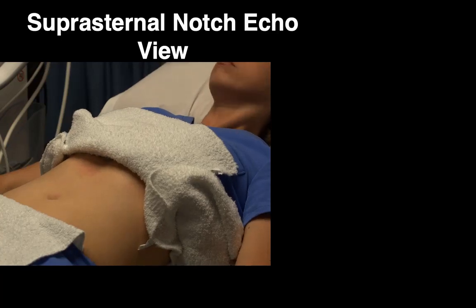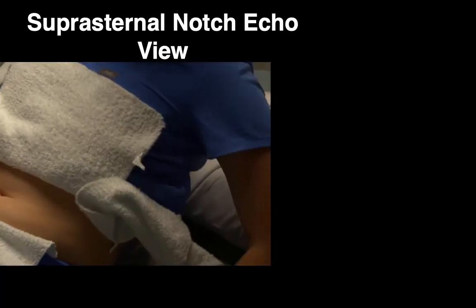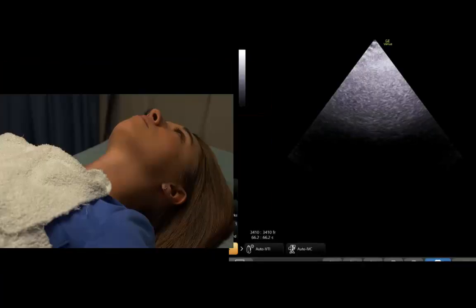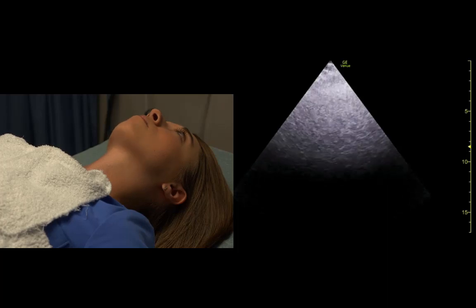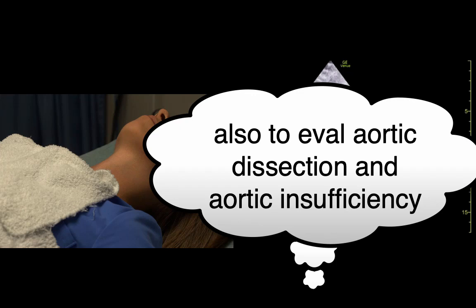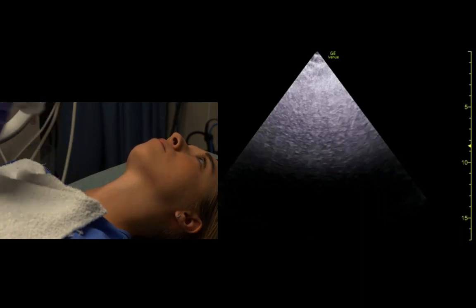I'm going to take your pillow and put it underneath your back, so your head goes backwards. This is the suprasternal notch view. If you want to look at the aortic arch, this is done a lot more in pediatrics than adults because you can get a lot of good pediatric views from up here. We get right in the suprasternal notch.